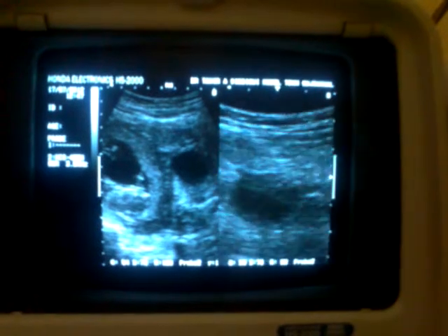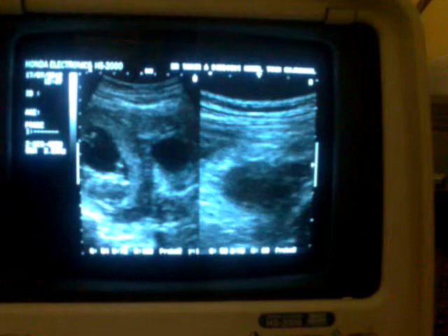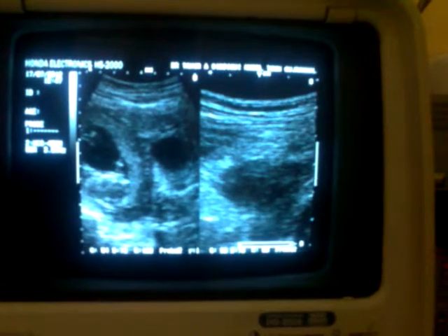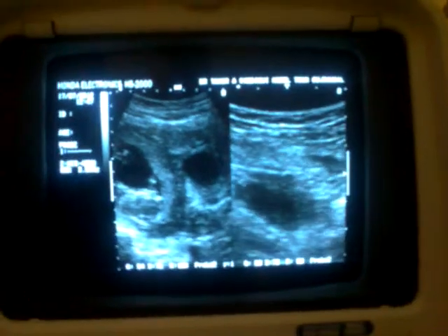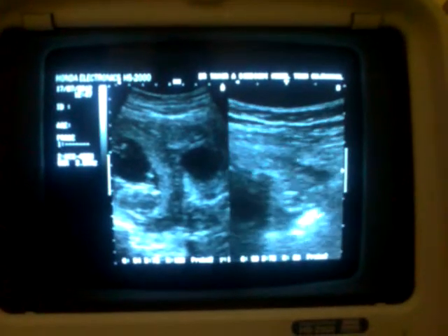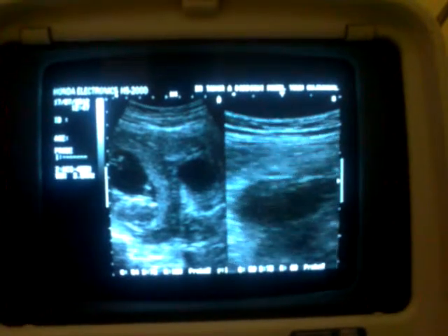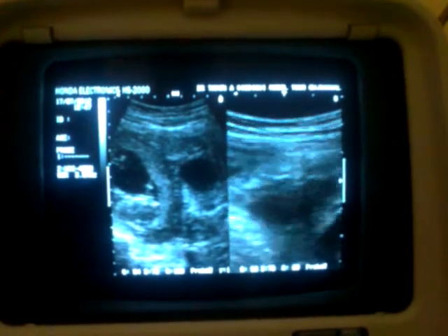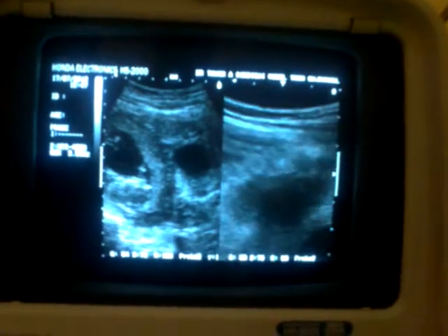Here it is, with an echogenic ring around it, but not as regular as what you are seeing in the other portion. Patient is extremely tender in this region.